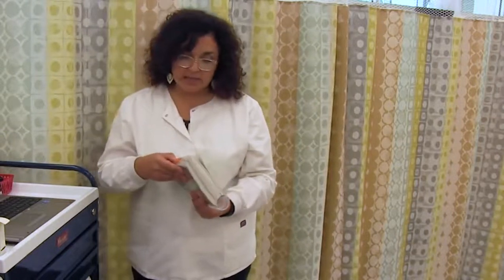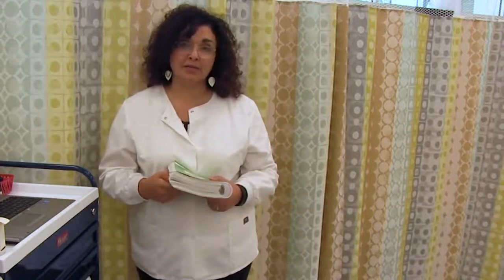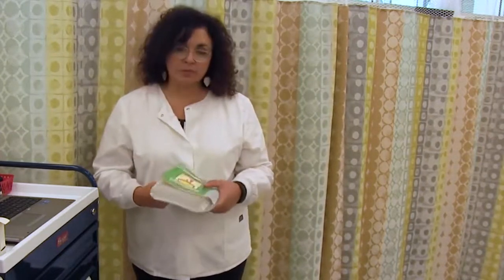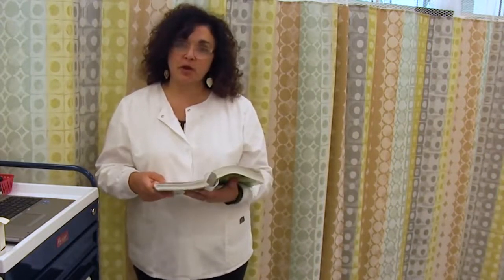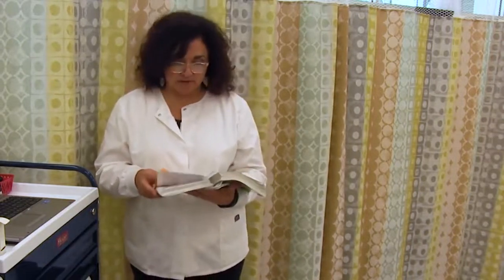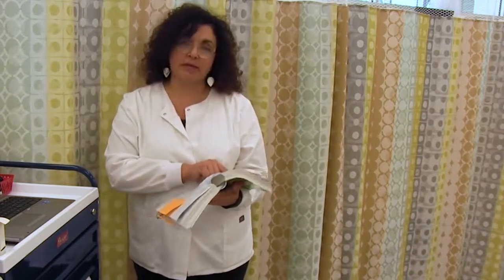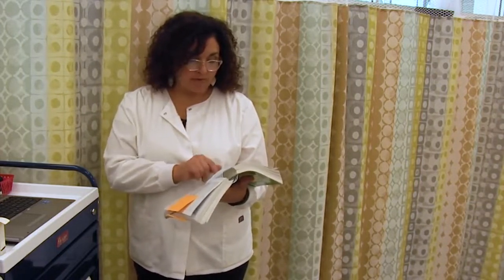A, is it appropriate? In this particular scenario, I'm going to be giving Toradol, which is ketorolac tromethamine, the generic, to Mr. Tom Silver. This is a pain medication that he's requested. I am going to look up the drug information, and I am going to see first and foremost, is it appropriate for the IV push route? In my drug book, I see that it says may be given undiluted. That gives me the green light for IV push.